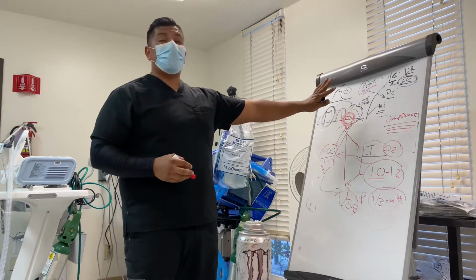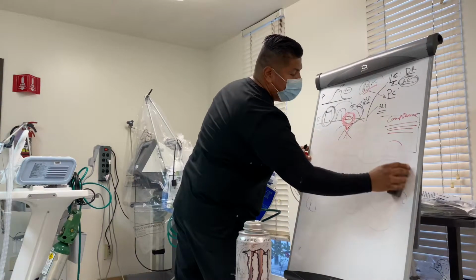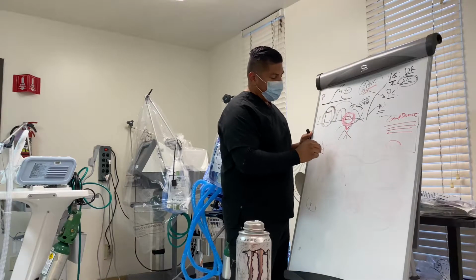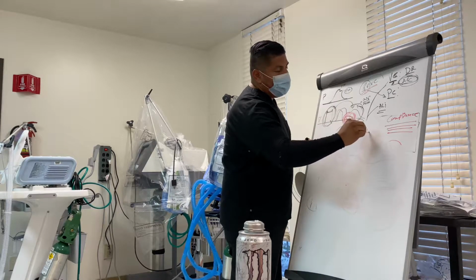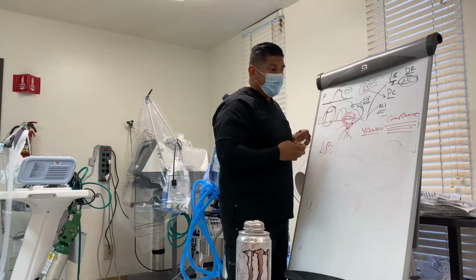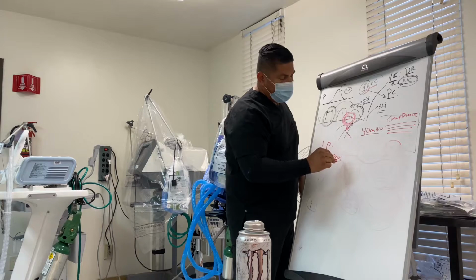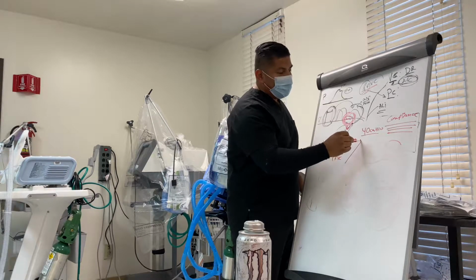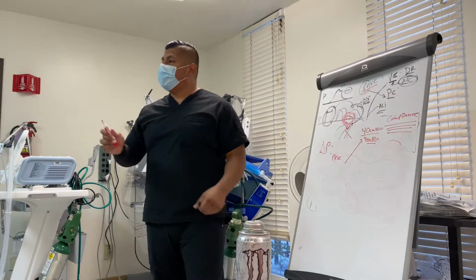So this also has a cutoff point, and it's based off your high pressure alarm. We said that the PRVC is going to adjust the inspiratory pressure. Another name for inspiratory pressure is delta P. So it's going to change the inspiratory pressure, but let's say your high peak pressure alarm is 40 centimeters, because you're following the NBRC guidelines. The PRVC will adjust the inspiratory pressure at the max 5 centimeters below your high peak pressure alarm. So it'll cut off at 35 centimeters of water pressure.